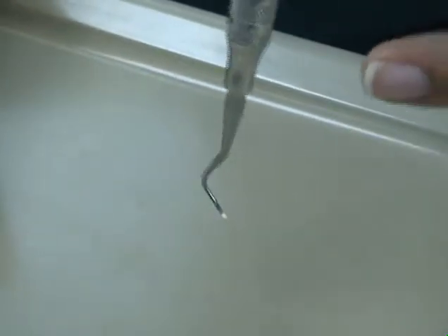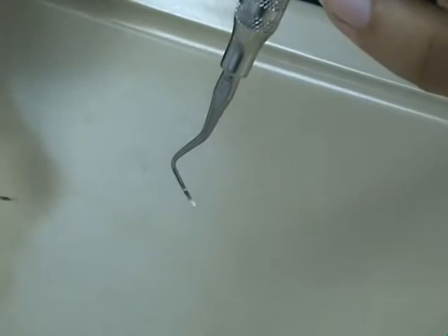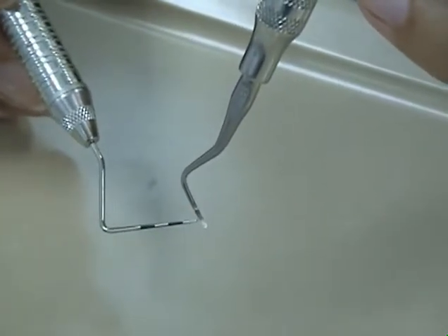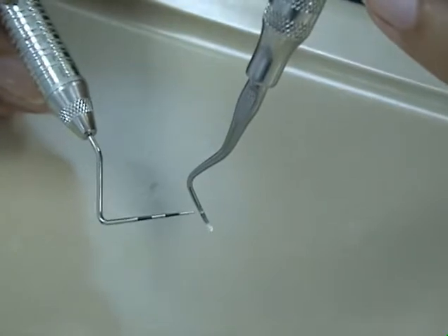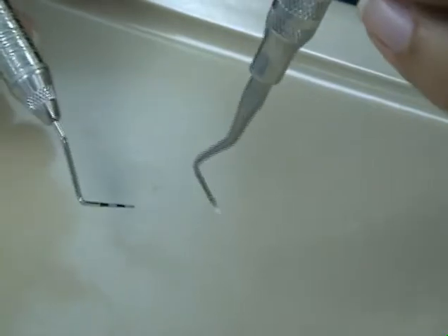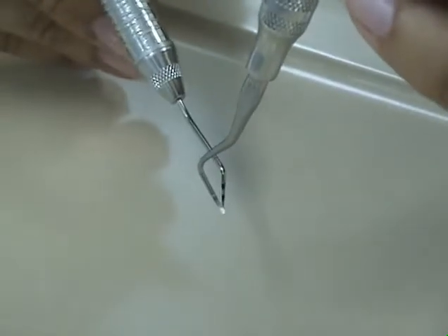The face of the curette is divided into three sections: the toe or lower third, the middle third, and the heel or upper third. The universal curette has two edges: an inner cutting edge and an outer cutting edge.